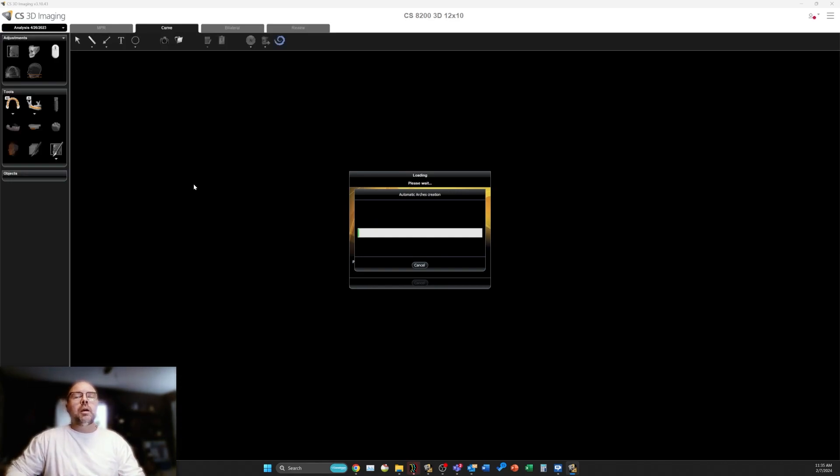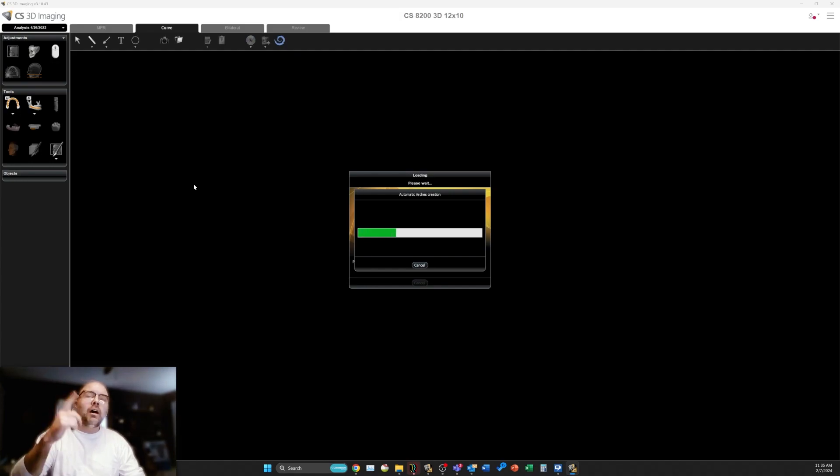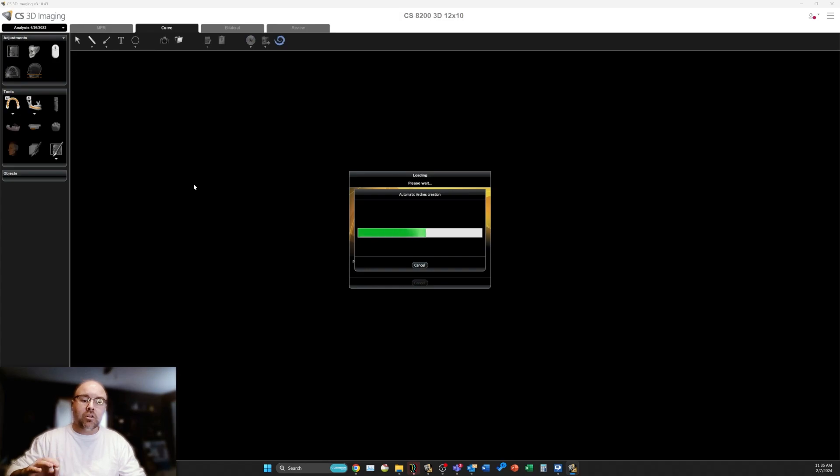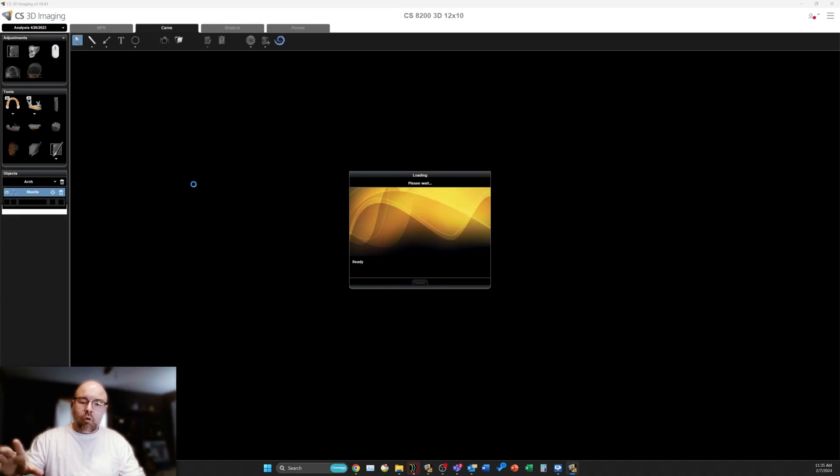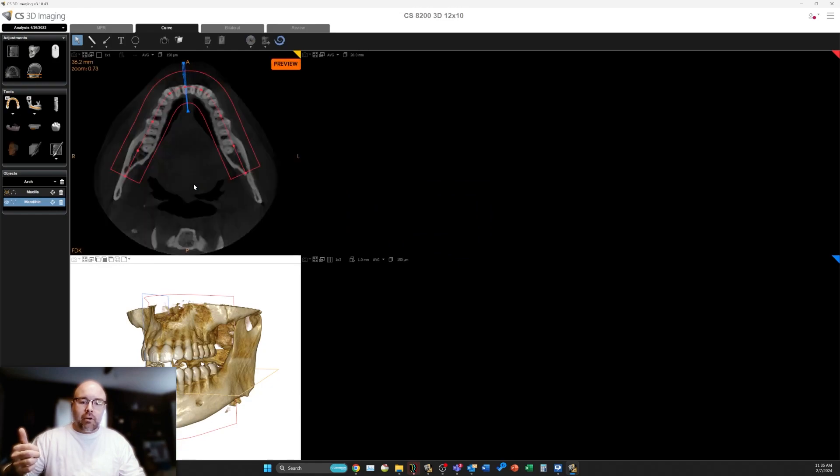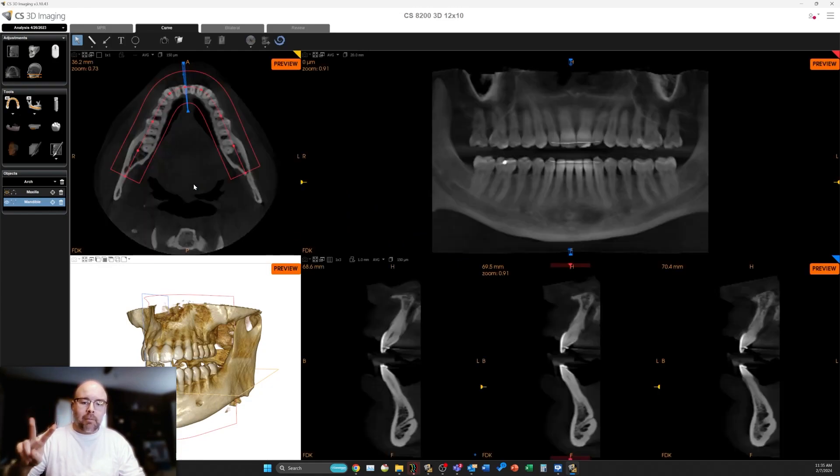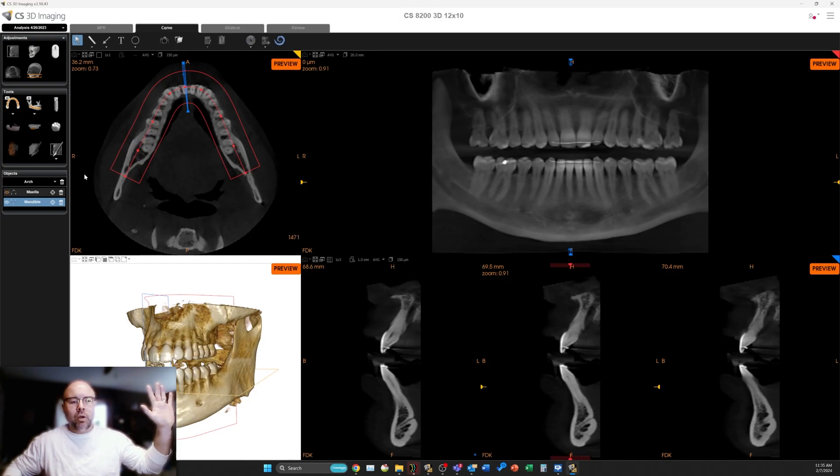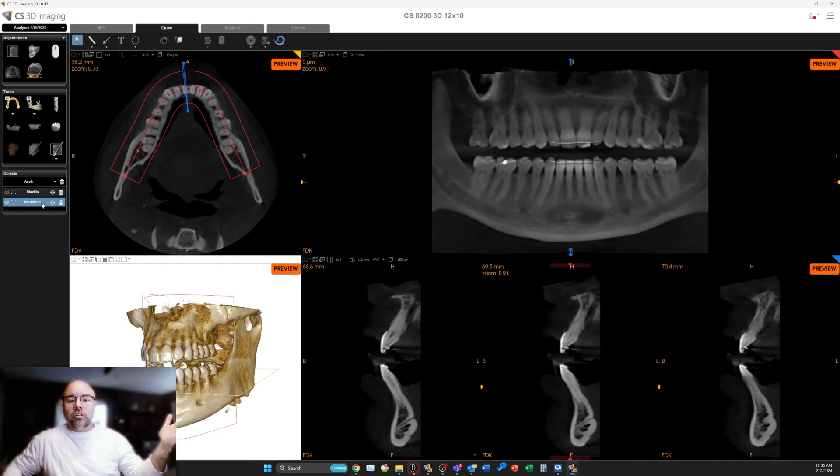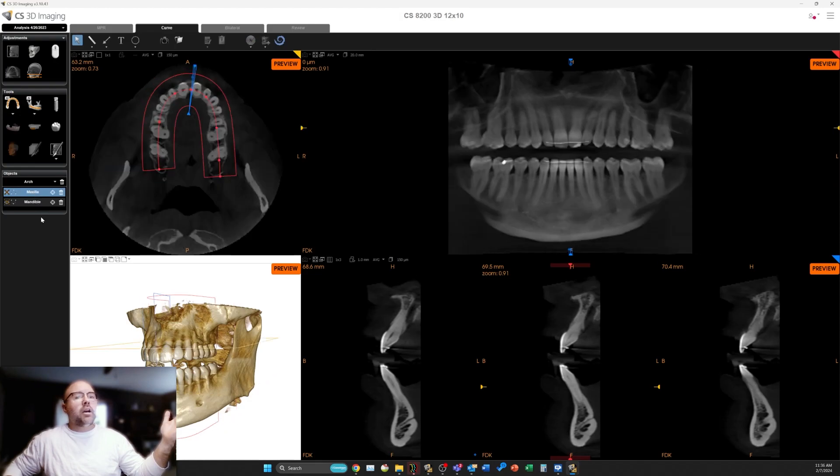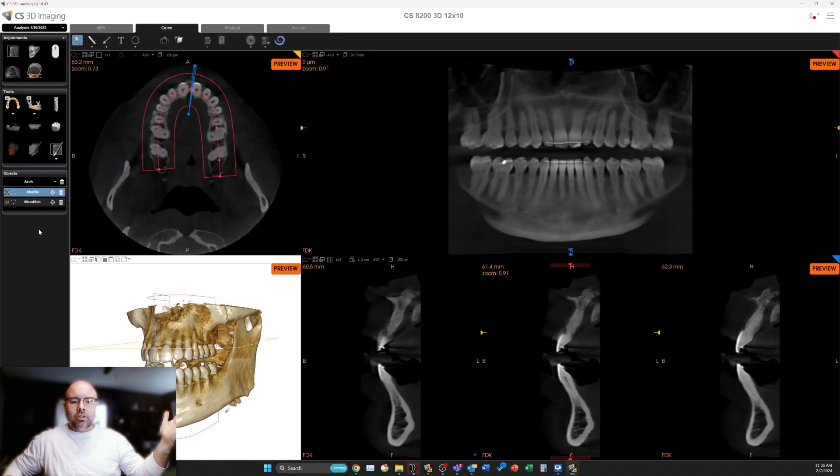Right off the bat, when opening up this case for the first time, we have a progress box letting us know that it's tracing out the arch, not just the mandibular arch as it's done before, but also the maxillary arch. So we get two arch tracings in the same scan. It opens right up to the mandibular arch and that looks really good. Let's check out the maxillary arch too, and that also looks very good.